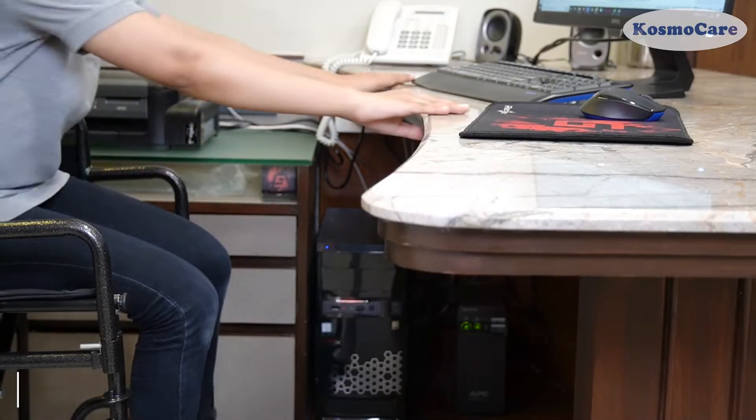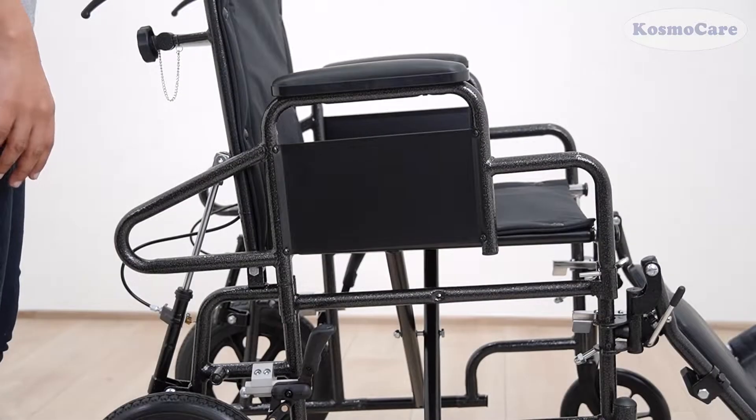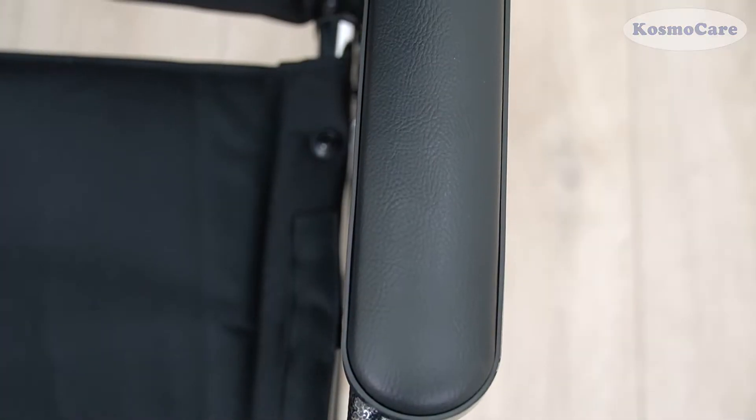The desk jet design facilitates rolling the wheelchair easily under the desk for working users. Fully detachable armrests offer great convenience to transfer the user from the wheelchair and back, and the cushioned armrest provides a comfortable ride.